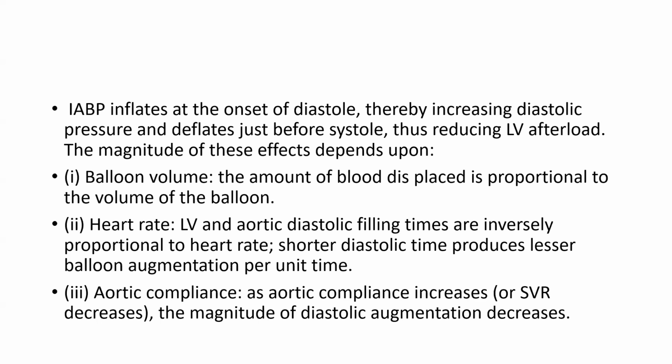Then heart rate. Aortic diastolic filling time is inversely proportional to the heart rate. So shorter diastolic time produces lesser balloon augmentation per unit time. Then aortic compliance. As aortic compliance increases, the magnitude of diastolic augmentation decreases.